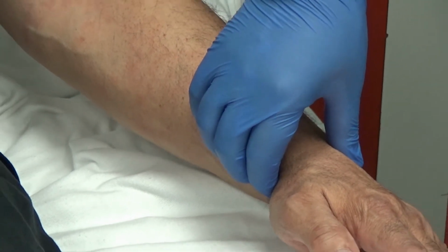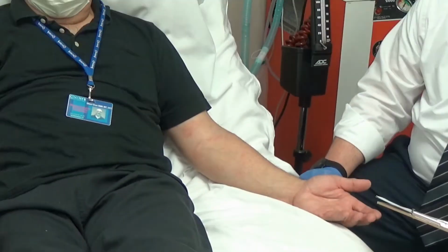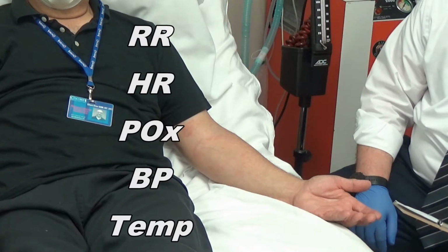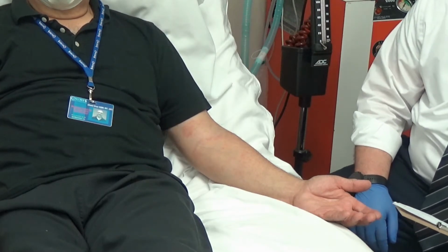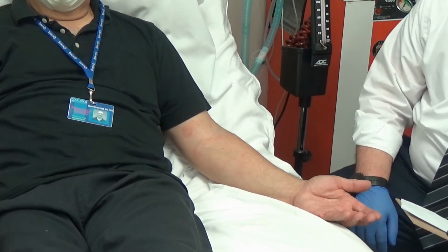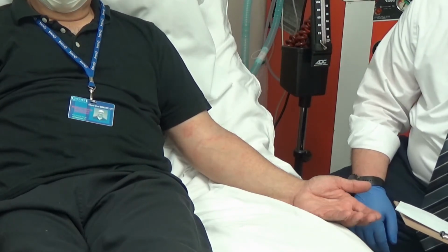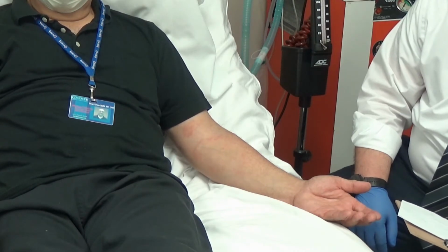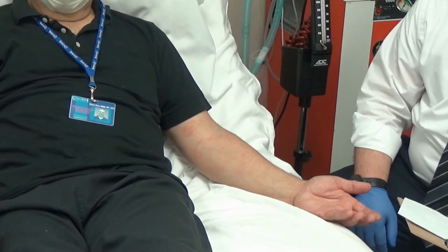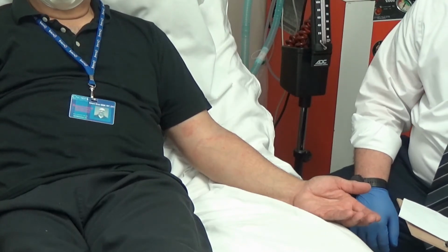So again, you always want to make sure you feel for a pulse, even though you have the pulse on your pulse oximeter. When checking vital signs, the primary ones you're going to check are respiratory rate, heart rate, oxygen saturation, blood pressure, and body temperature. Realistically, as respiratory therapists, the four most important ones to you are respiratory rate, heart rate, oxygen saturation, and breath sounds. We'll talk about breath sounds in a later lab. You will have to monitor blood pressure and body temperature. These are very good things to know, but as respiratory therapists, these aren't things that we typically document.